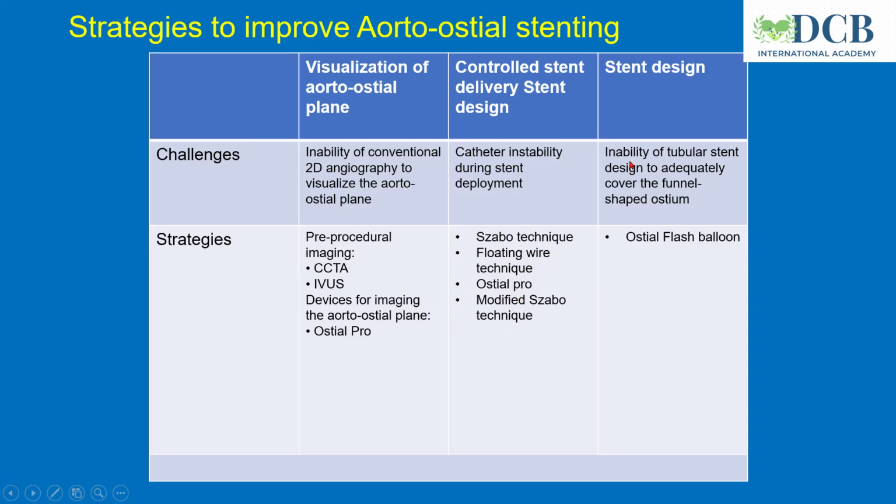Another thing is what can we do with regards to stent design. Actually the ostium is not really a cylindrical or tubular structure, it's actually funnel shaped. So there is something known as the ostial flash balloon, which can make the stent approximate the funnel shaped ostium better.